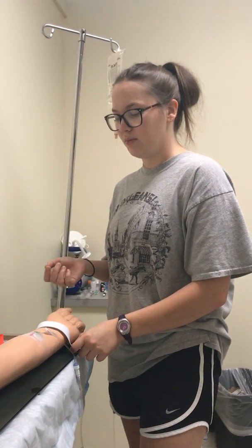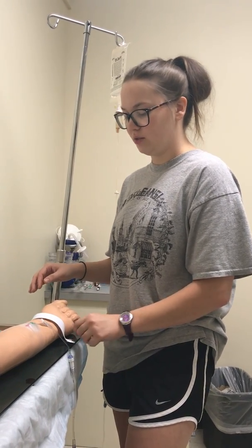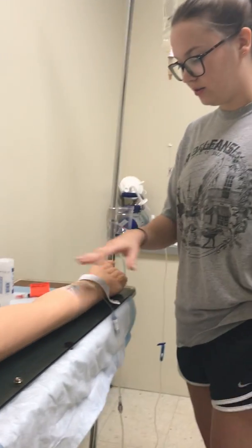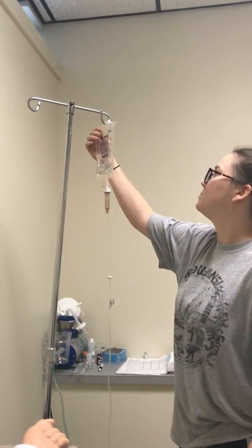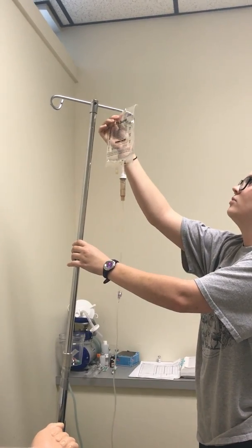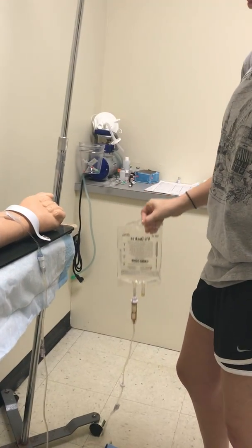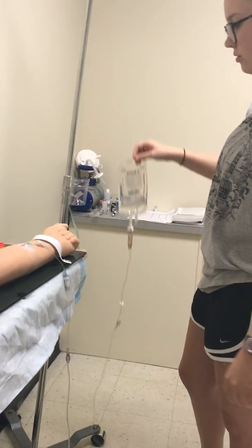I would ask him to give me his name and date of birth. And that one's right, so we got the right patient. I would ask him to tell me if he has any allergies, which he would say no. I'm going to assess the site, make sure there's no swelling or redness in order to see if it's patent. And I would also check again that we have D5W in the room, which we know is compatible. I would check for patency by lowering the bag and looking for blood return, and we see some, so we know it's open.